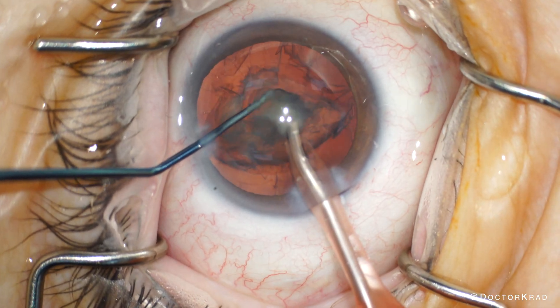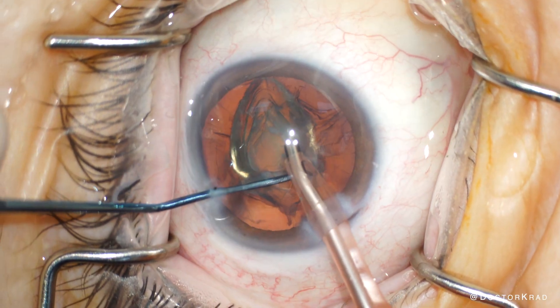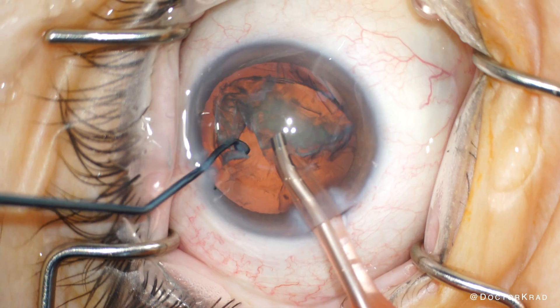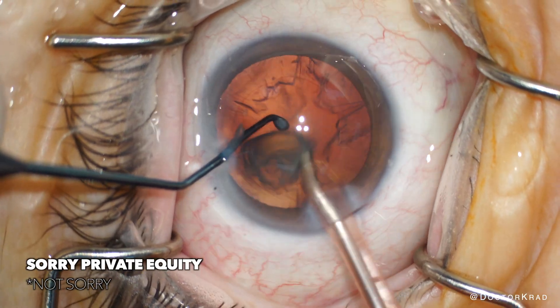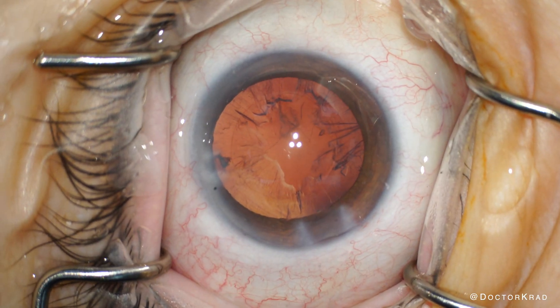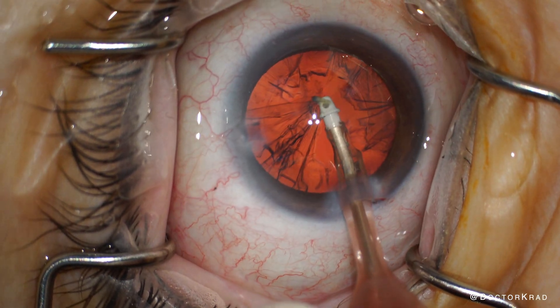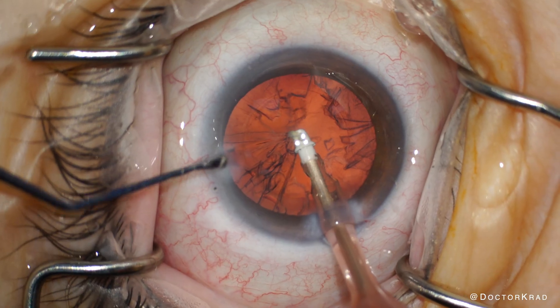Fortunately, we did not encounter any problems with her cataract surgery — everything went routine. I opted not to perform laser-assisted cataract surgery and to implant a basic monofocal IOL. The patient was willing and able to pay for femtosecond laser-assisted cataract surgery, but I didn't recommend it because the only thing worse than blurry vision after cataract surgery would be blurry vision after spending thousands of dollars out of pocket. Subtle differences from the laser or improvements from an adjustable lens like the light adjustable lens would not have been noticeable to this patient, so I did not offer it.